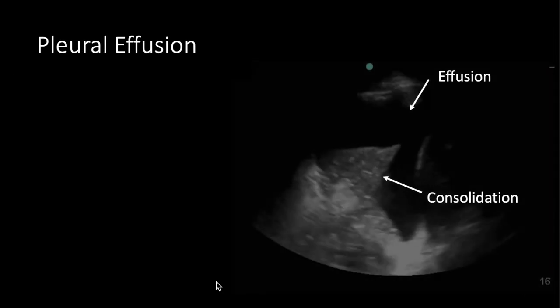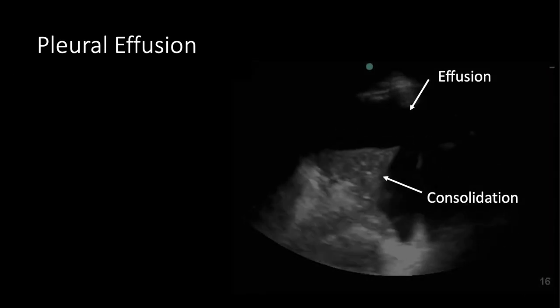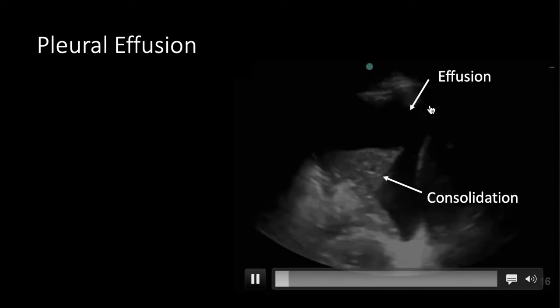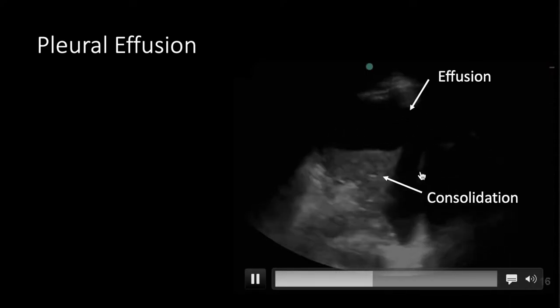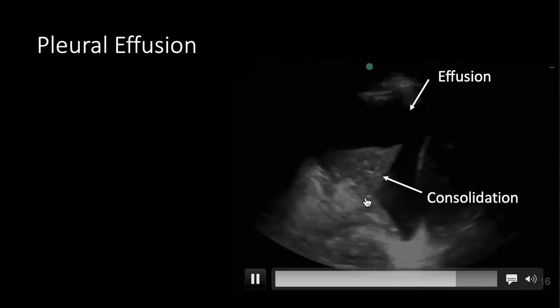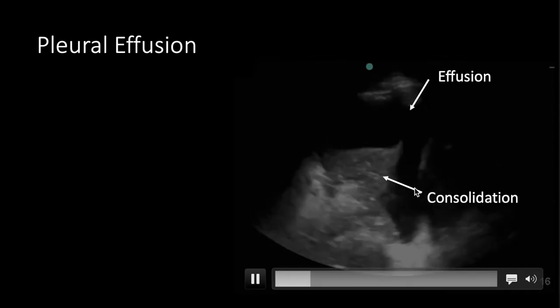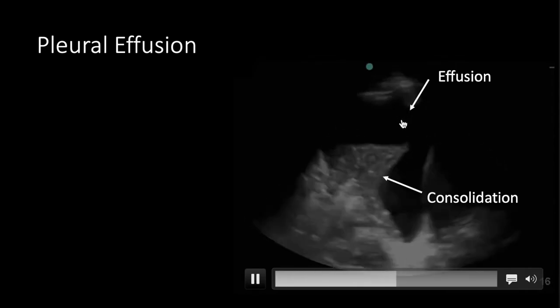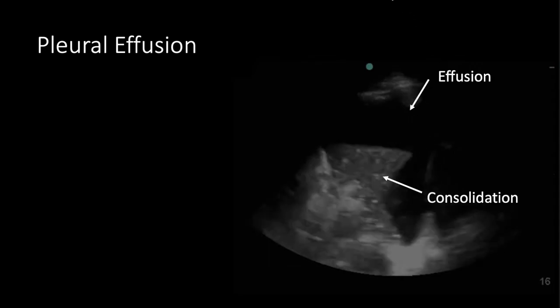Let's transition to pleural effusion. Here's an example of extrinsic compression. You can see the black anechoic fluid taking up space and squishing the lung, causing a consolidation pattern. You don't see any dynamic air bronchograms here because the lung is being squished.